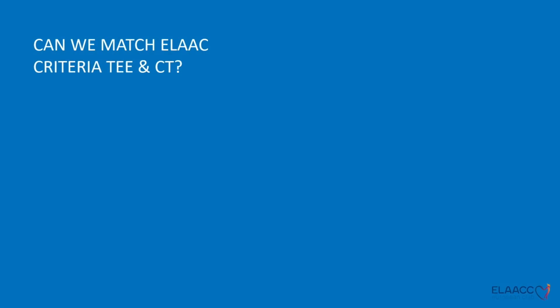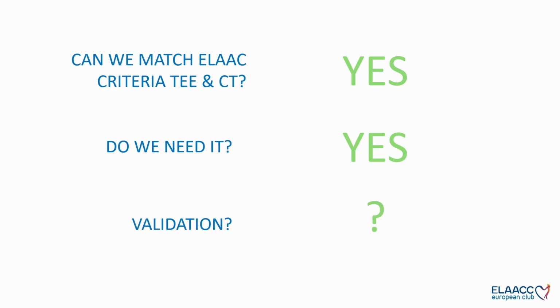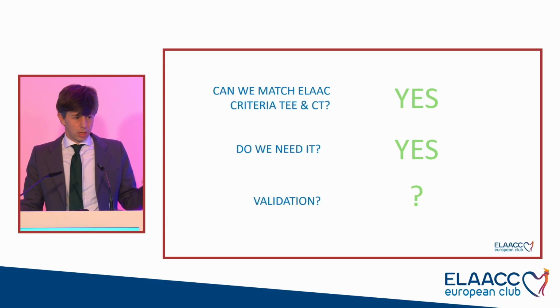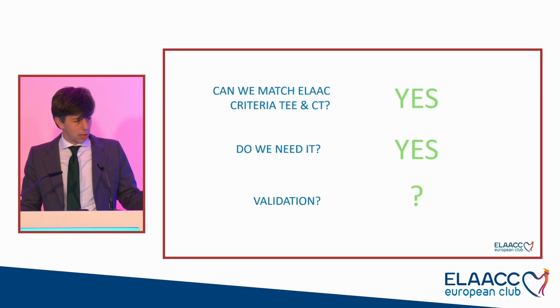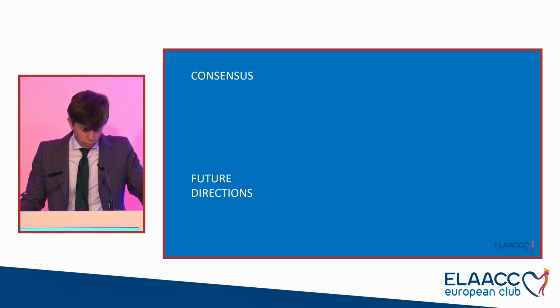Finally, Nina has shown us that it's quite easy, or rather feasible, to match ELAAC criteria, TE with CT. Do we need it? We have already said that. I totally agree that we need to do this, because there are many centers that are still using TE, so it makes total sense to match our criteria with TE and CT. What I'm not sure about is whether we need an extra validation. That is something that is open for discussion. Do we need to validate these ELAAC criteria just based on CT, or will we translate the CT result into TE? So finally, consensus and future directions.